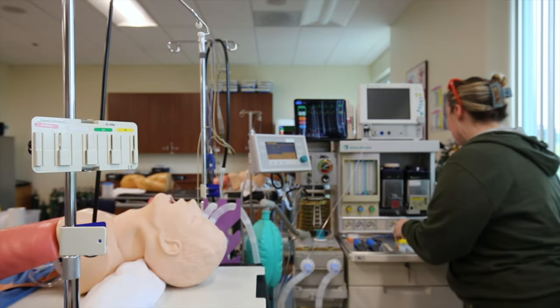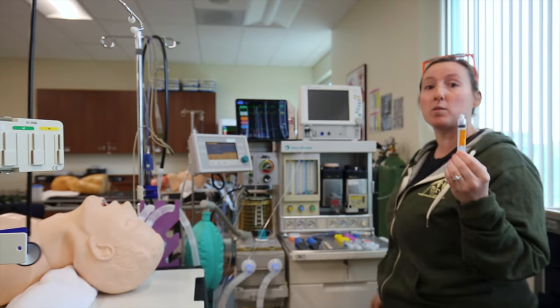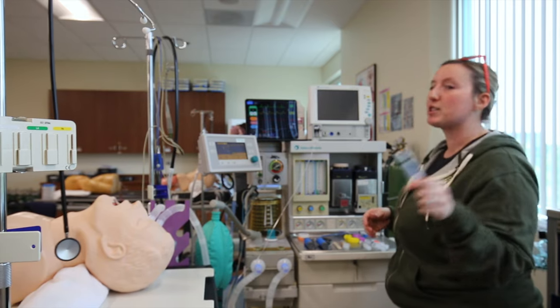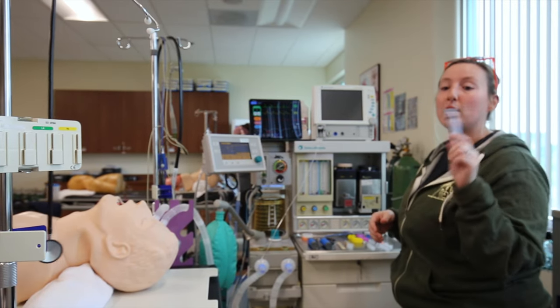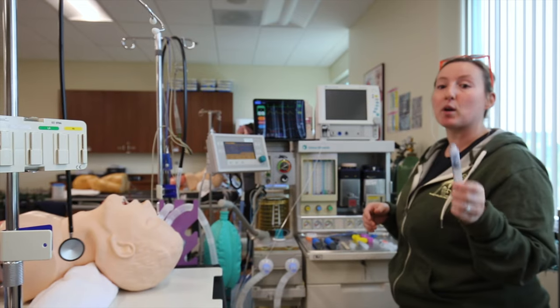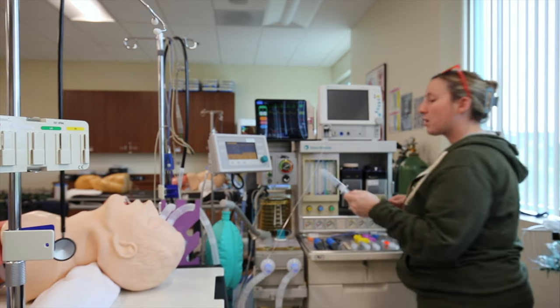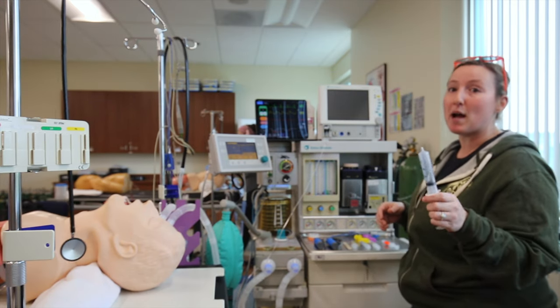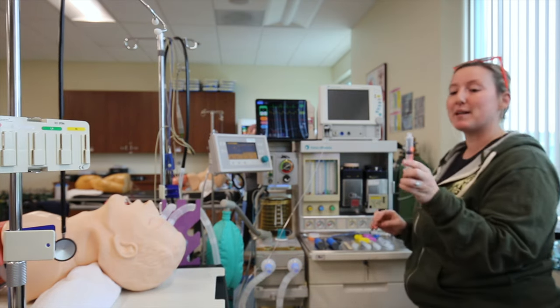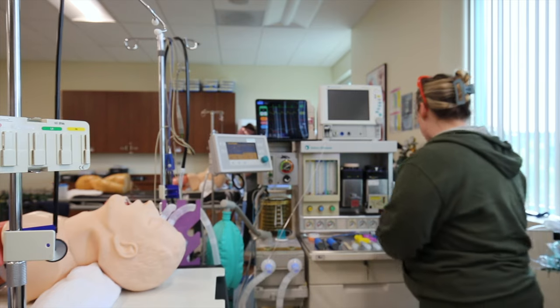For drugs — my induction drugs: I have Versed 2 milligrams, which is 1 milligram per ml, so 2 ml. Fentanyl is 50 mikes per ml, I have 2 ml — 100 mikes. Lidocaine is 20 milligrams per ml, I have 100 milligrams in 5 mls. Propofol is 10 milligrams per ml, I have 200 milligrams in 20 mls. Rocuronium is 10 milligrams per ml, I have 6 mls — 60 milligrams of rocuronium.